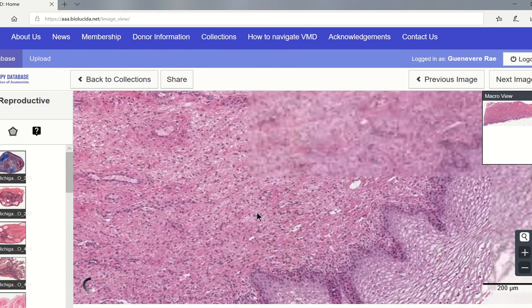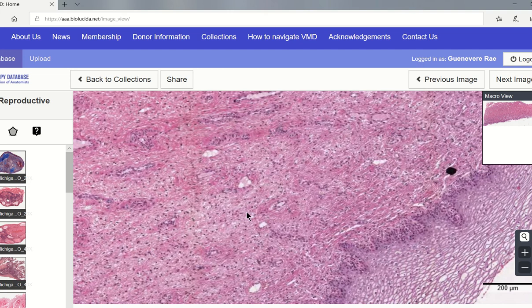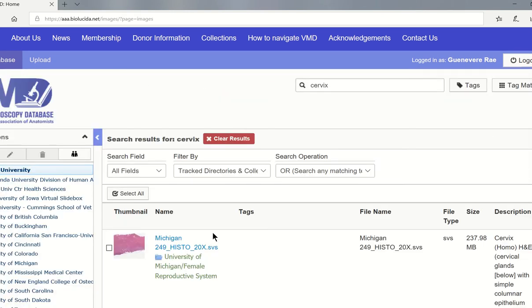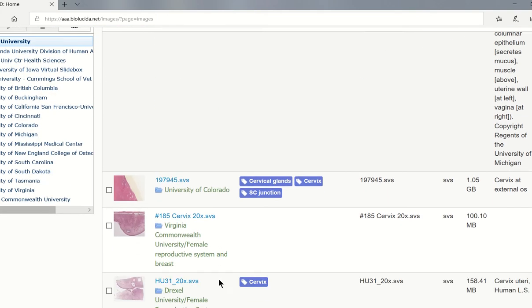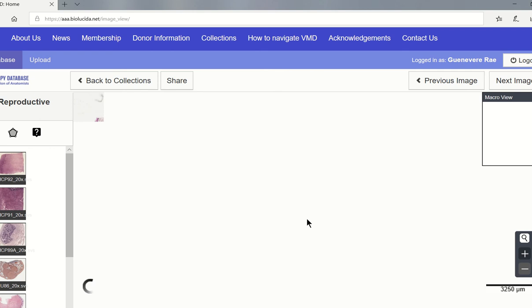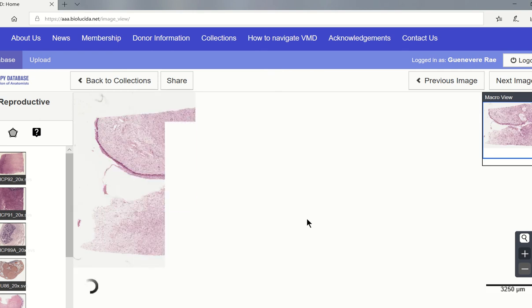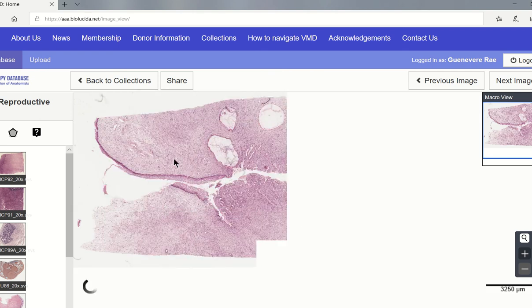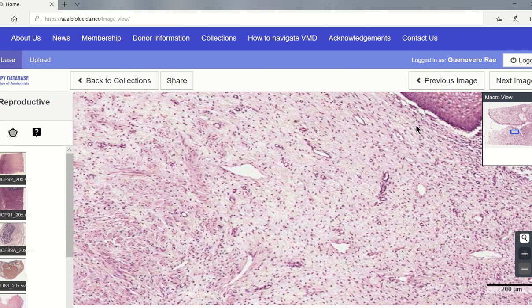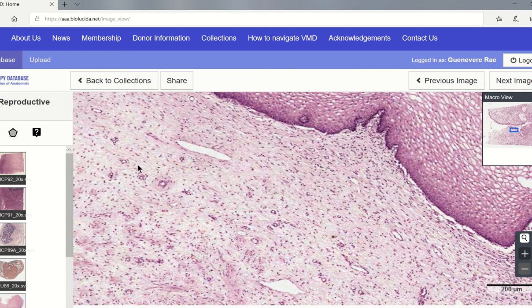But then when you look underneath the epithelium, it has a lot of connective tissue, and that is very characteristic of the cervix. And why I bring that up is because here's the slide that I used to make the question. And you can see, even just from this magnification, that the cervix has a lot of connective tissue underneath here. Just sort of even loose connective tissue.